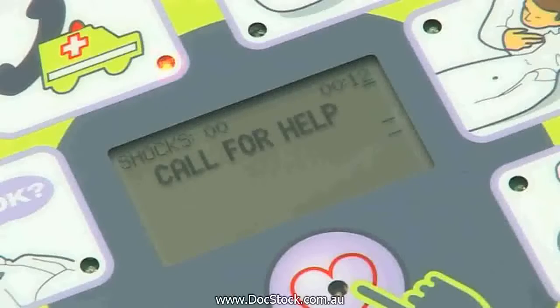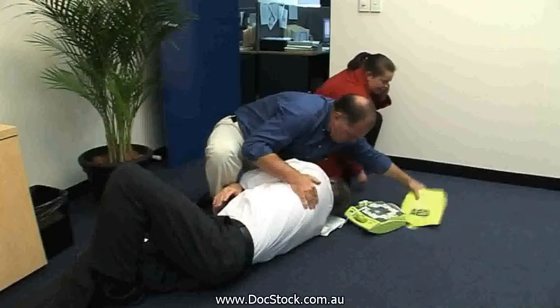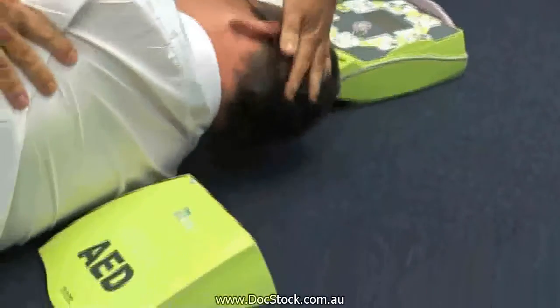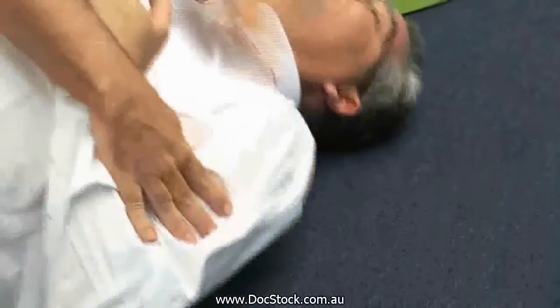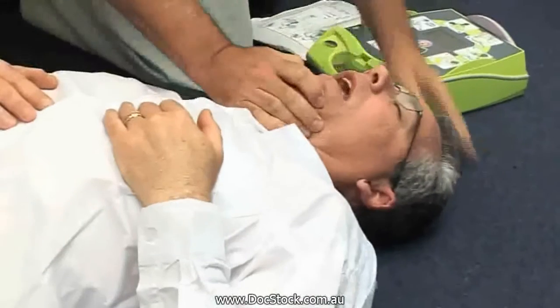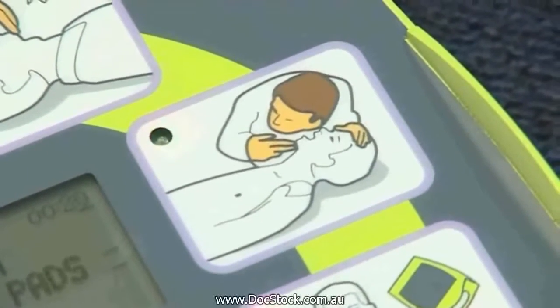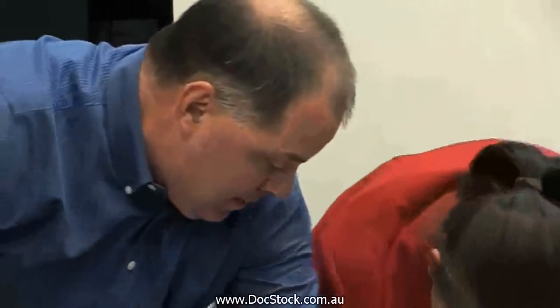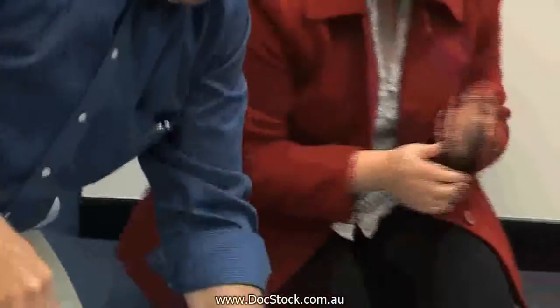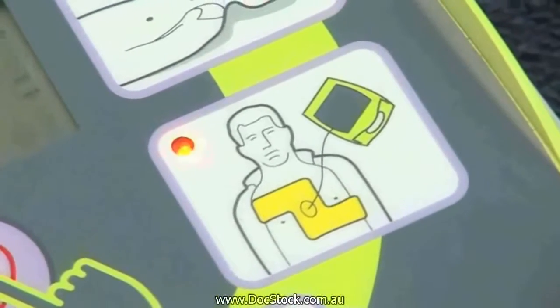If you suspect that the person has had a cardiac arrest, then immediately have someone call an ambulance. The next step is to lift the chin and tilt the head back to open the airway. Check breathing by looking at the chest to see if it is rising and falling, and listen and look for air flow exhalation.